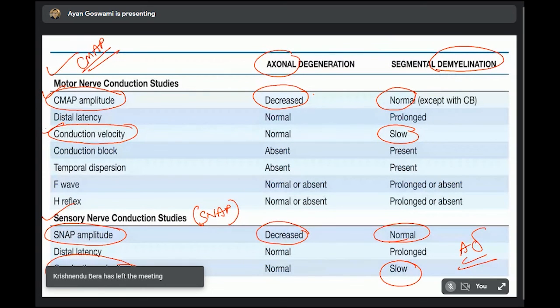Okay, so for the upper limb we will be testing all 3 nerves: median nerve, ulnar nerve, and radial nerve, and 2 components. You know, one nerve conduction study requires at least 2 hours to perform for a single patient, because in the upper limb you will be testing motor and sensory, median, radial and ulnar nerves on the left hand side, then the right hand side. Then in case of lower limb, if you completely perform nerve conduction study for a patient, it will require a minimum of 2 to 3 hours. It may require more, right? Yes, sir. Okay, any more questions?